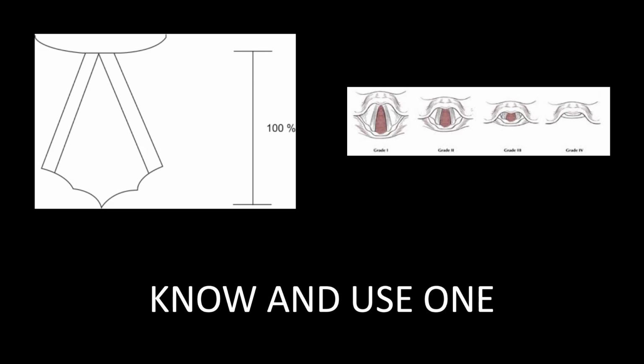We prefer a POGO system as it's more intuitive in terms of what you're visualizing. However, there are a lot of physicians that are unfamiliar with this communication strategy, so don't be shocked if you say you have a POGO of 25% and your consultant has no idea what you're talking about. You may need to elaborate later on, but being comfortable with both is very important.